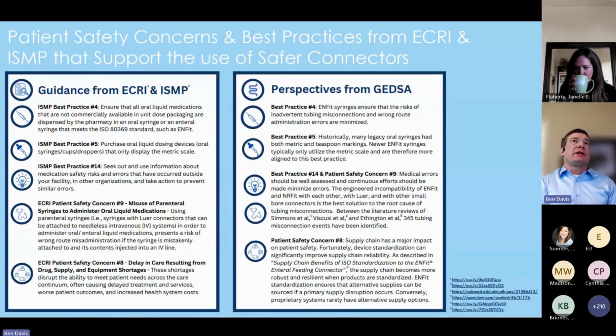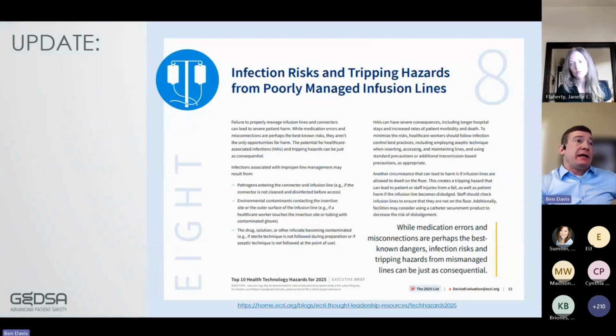So I just wanted to quickly share this. I'm not going to read through all these, but just wanted to share quickly as a resource. You can actually basically satisfy a lot of these best practices simply by switching to these safer connectors. And an update there, because what I just shared with you was based on the latest lists that were available. So basically ISMP's 2024 and then ECRI's 2024 listings.